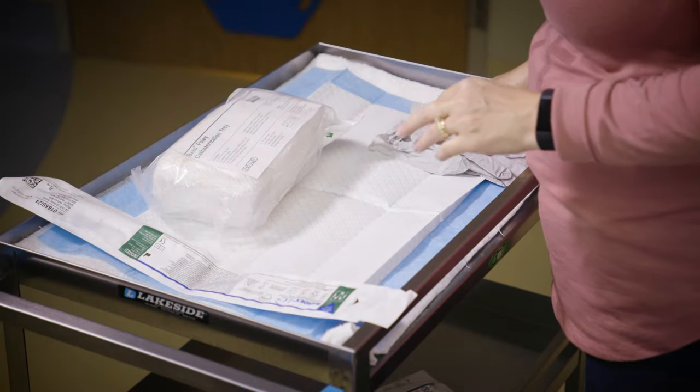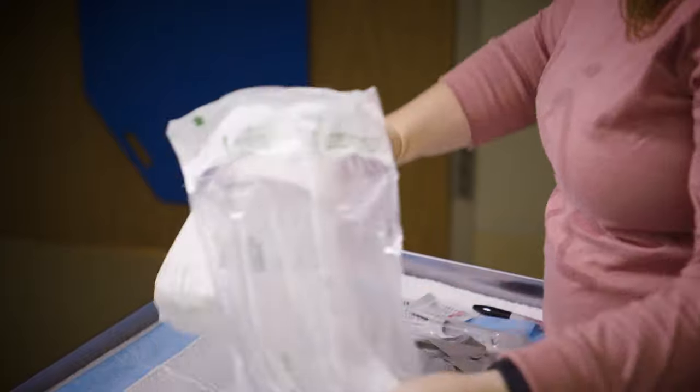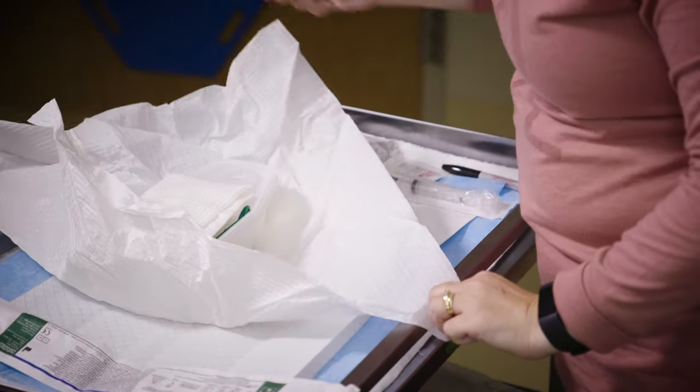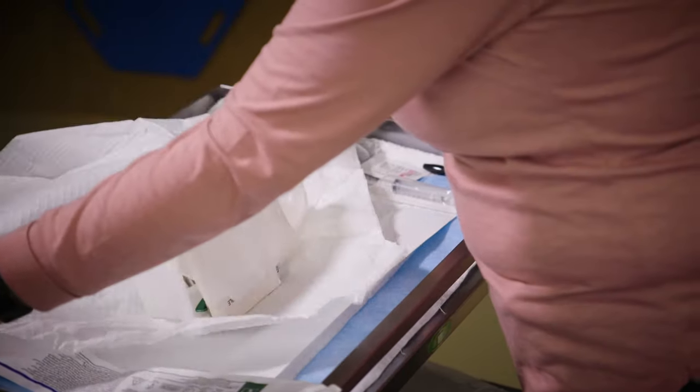First, open the catheter insertion kit. To open, remove the outer packaging and then unwrap each corner carefully to create a clean workspace. Do not touch any of the supplies in the kit while your gloves are off.